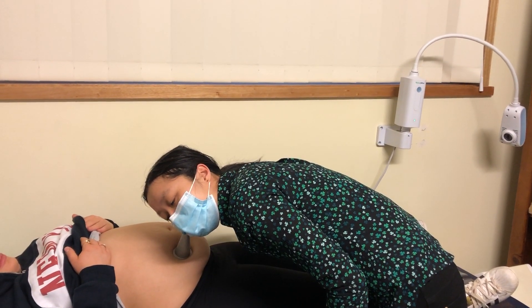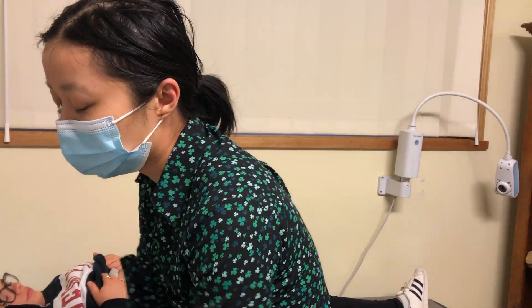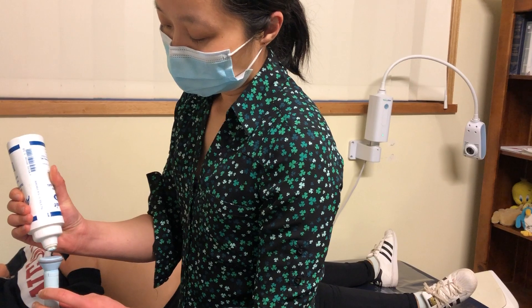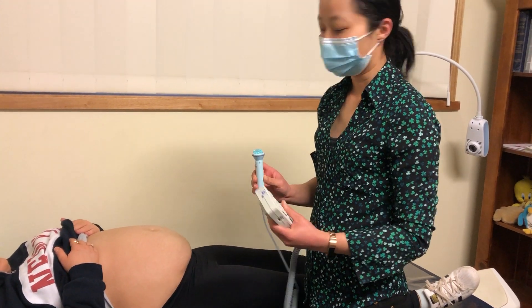You're generally not making any other contact with the stethoscope apart from your ear. The other device we use is the Doppler — you put some of the coupling gel on and apply it over the same area.